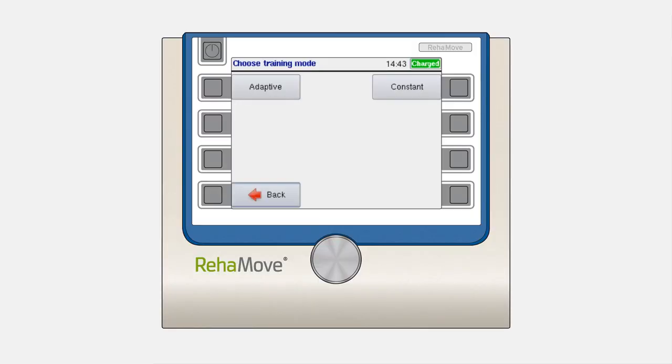When you have chosen either Adaptive or Constant mode, you will be automatically forwarded to the Channel configuration. Here, you can choose between three options: unilateral, bilateral, or individual.